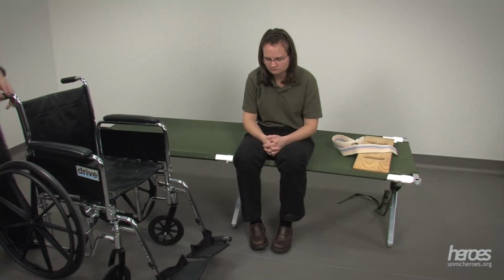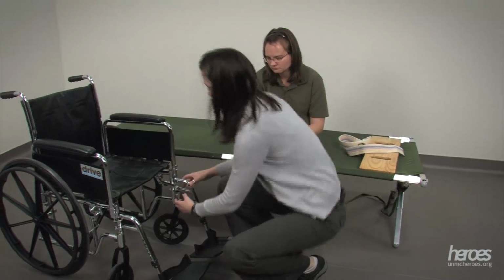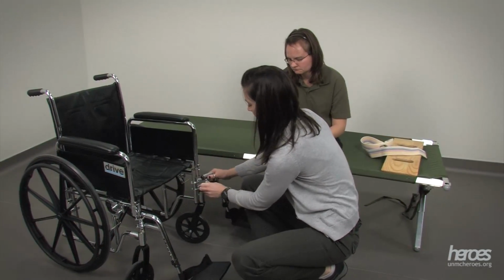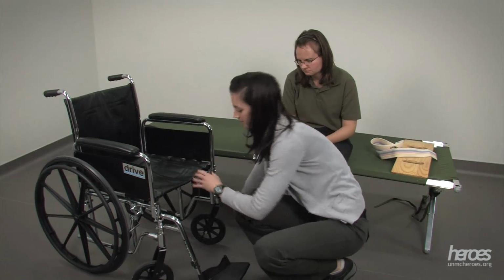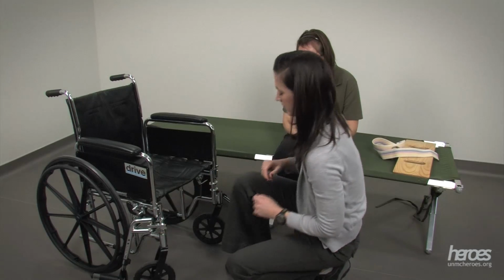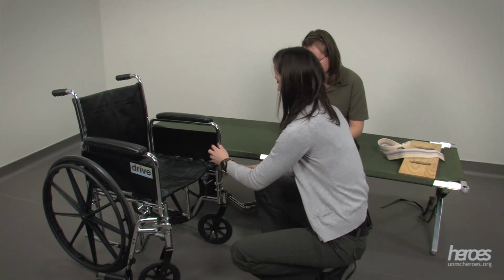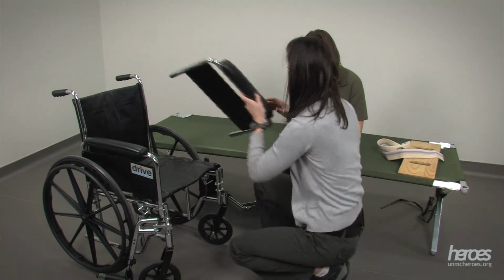Position the wheelchair near but several inches away from the individual on the cot. Remove the leg rest of the wheelchair that is on the side closest to the cot. Swing away the leg rest on the other side of the wheelchair so that it is not in your way during the transfer. Then remove the wheelchair armrest that is closest to the cot.